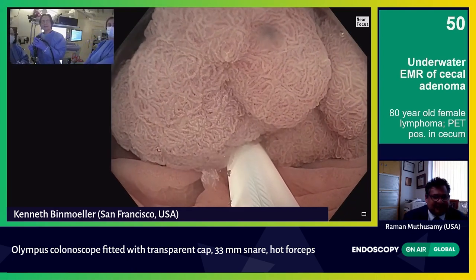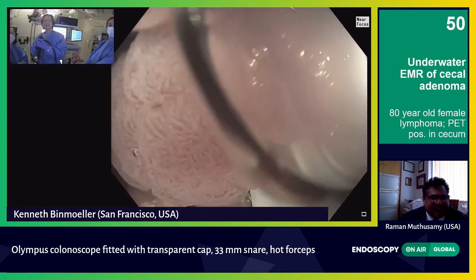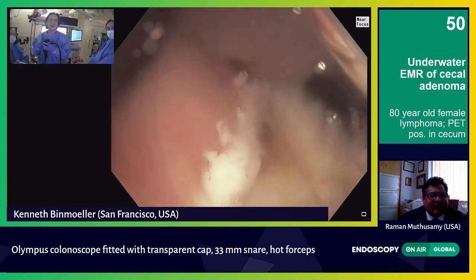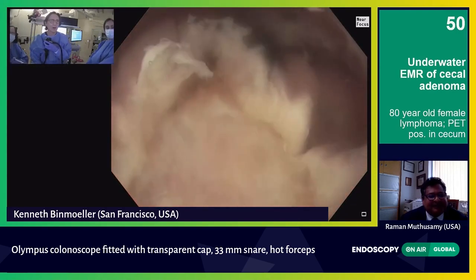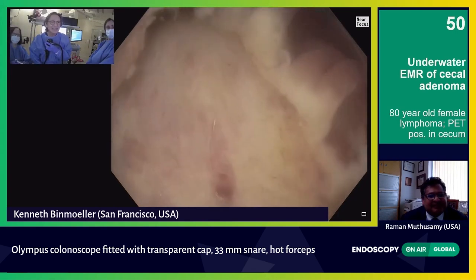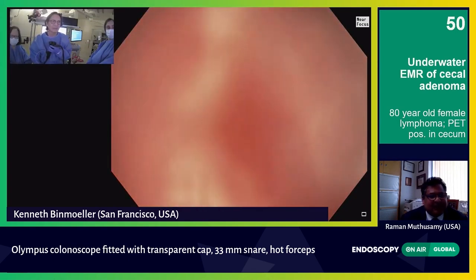Cut. Keep going. There — I think it's through. It's through. Let's look. Let's see what it looks like. I immediately give water and look. You can see this is the actual surface area — it wasn't that huge a lesion. Here we have a little bit of bleeding.